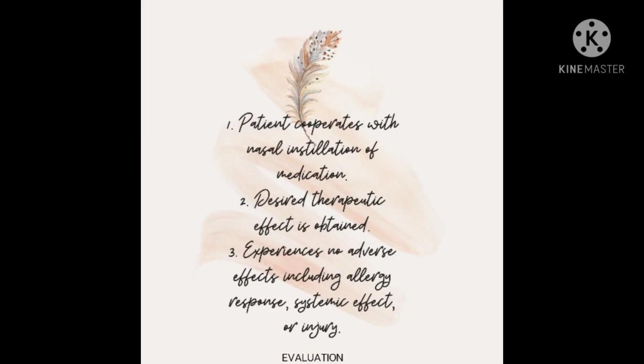Evaluation: the patient cooperates with nasal instillation of medication. The desired therapeutic effect is obtained. The patient experiences no adverse effects, including allergy response, systemic effect, or injury.